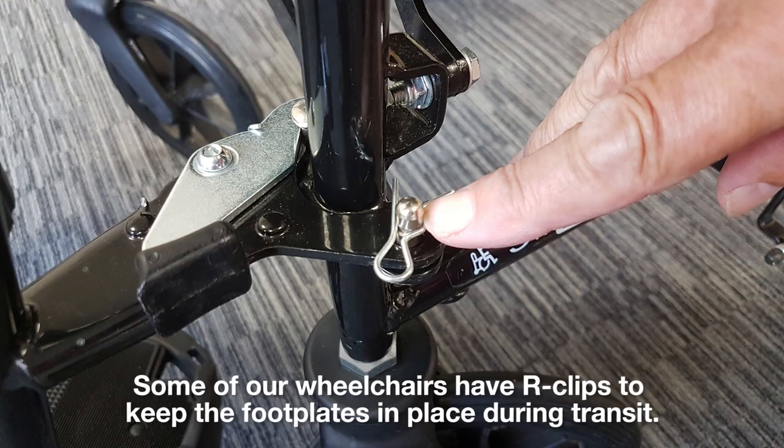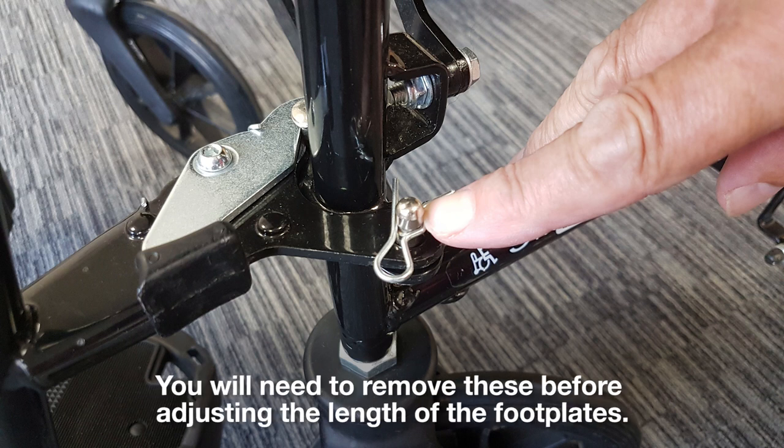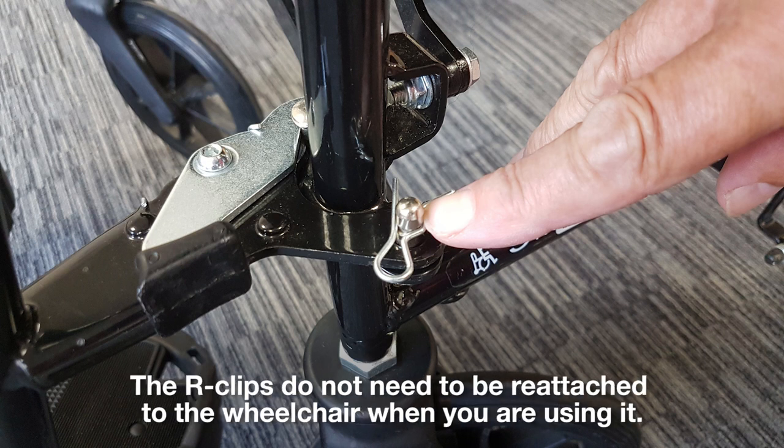Some of our wheelchairs have R-clips to keep the footplates in place during transit. You will need to remove these before adjusting the length of the footplates. The R-clips do not need to be reattached to the wheelchair when you are using it.